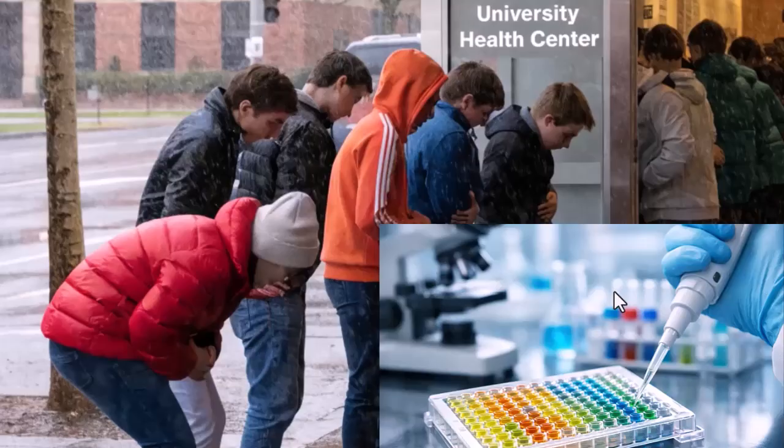Spectrophotometry is used to measure color intensity in a toxin ELISA. True. Mycotoxins like aflatoxin are produced by bacteria. False. They are produced by fungi.